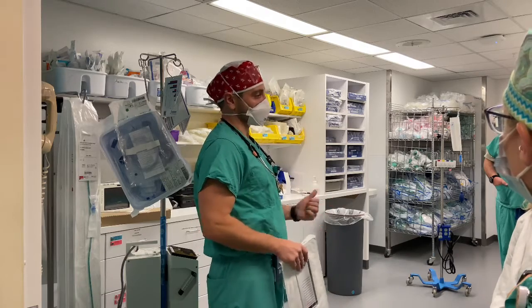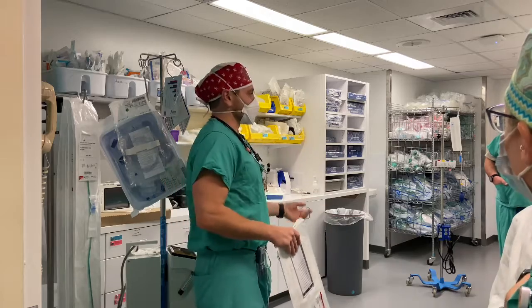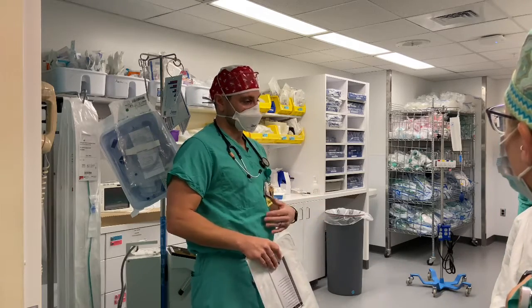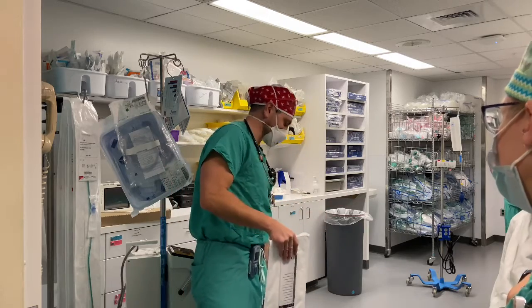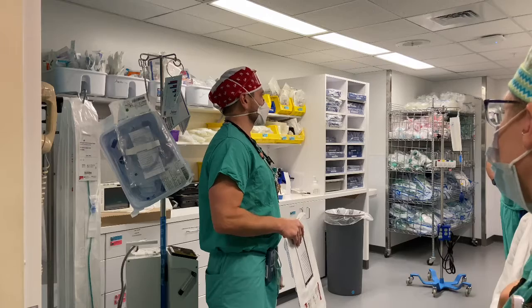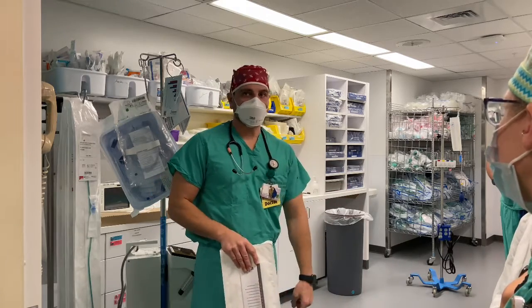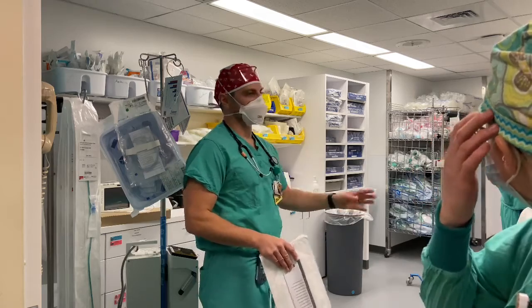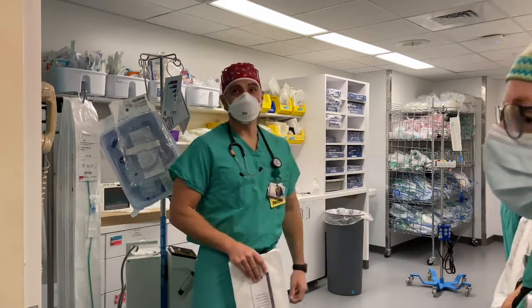So if the patient doesn't need muscle relaxant and we think it's going to make our lives easier, we'll use an LMA. If we think somebody's going to be hard to ventilate, even for something like a toe surgery, we're not going to use an LMA if we think it's going to make our life harder. So if somebody's 500 pounds, probably not going to put an LMA in, even if we're working on their pinky toe, because it's just going to be hard to ventilate them with the LMA because we can't blow as much positive pressure.